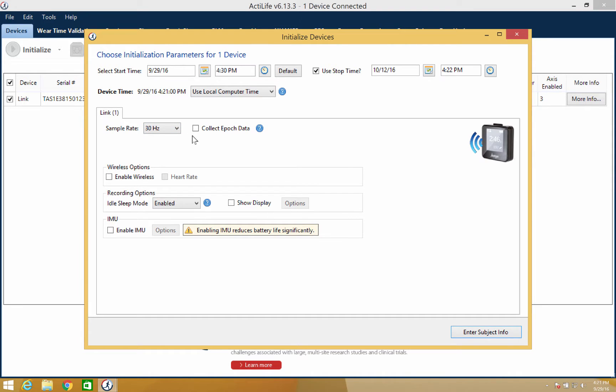The collection mode will remain in the raw format, but you also have the ability to turn on epoch data collection.